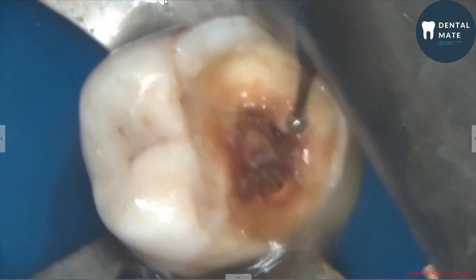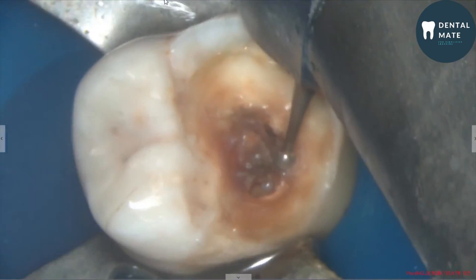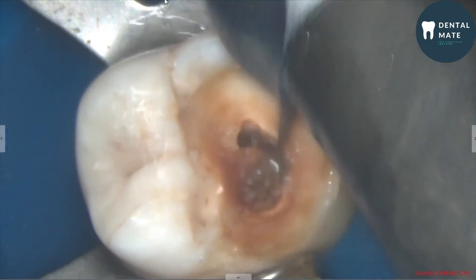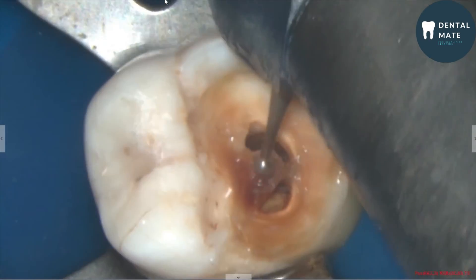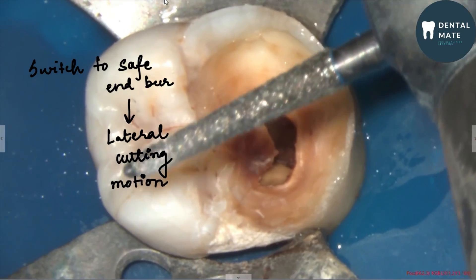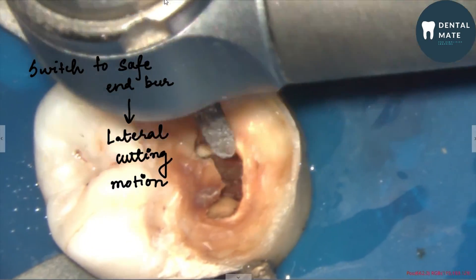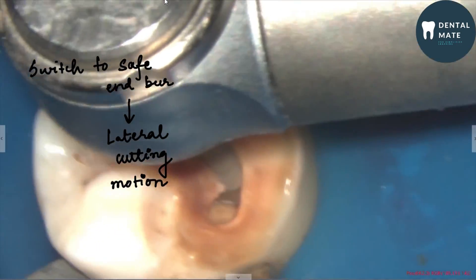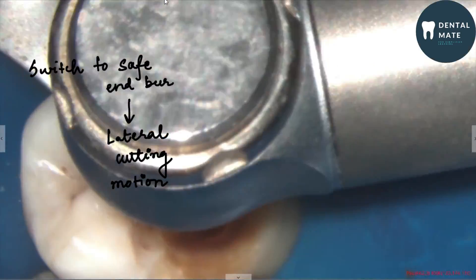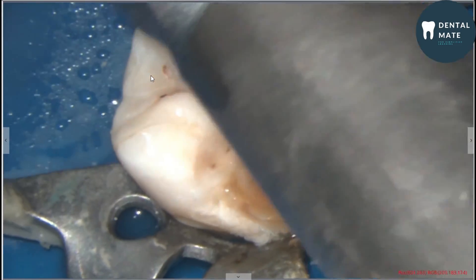After removing the slight caries still present in the periphery, we will start de-roofing the pulp chamber. Care should be taken not to use any burr on the floor of the pulp. We'll switch to the safe-end burr in a lateral cutting motion. In this video the lateral cutting motion is depicted — care should be taken not to run the burr on the floor of the pulp chamber.